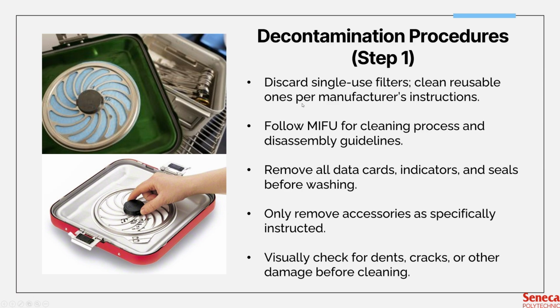You only take apart accessories when explicitly allowed. Over disassembly can actually lead to damage or missing pieces. Of course, finally, before cleaning, inspect for dents, cracks, or corrosion. Damaged containers should be tagged for repair or replacement.